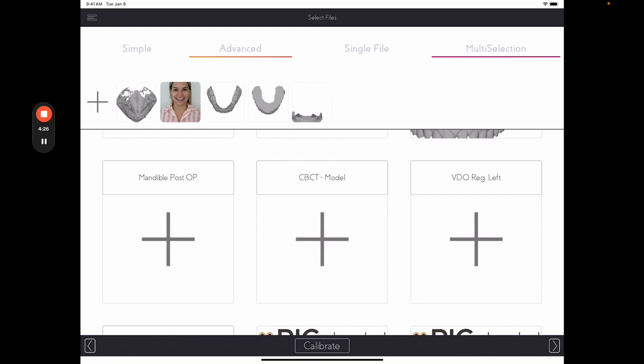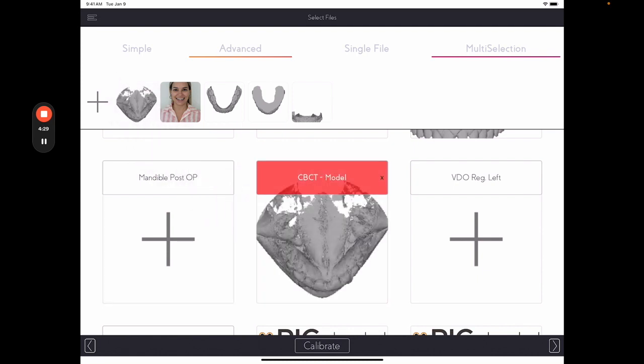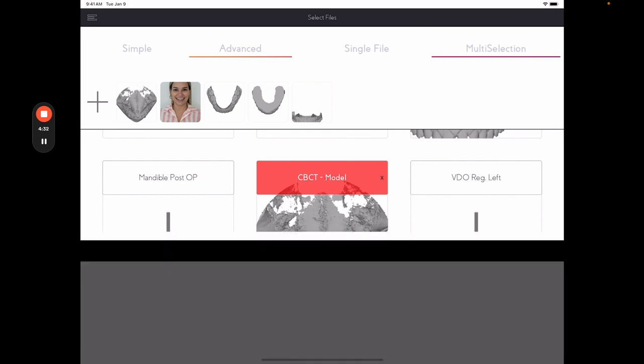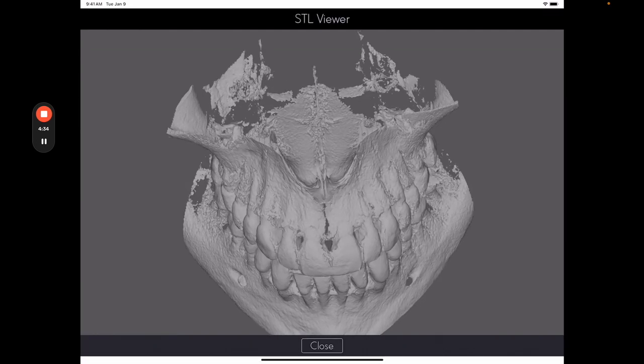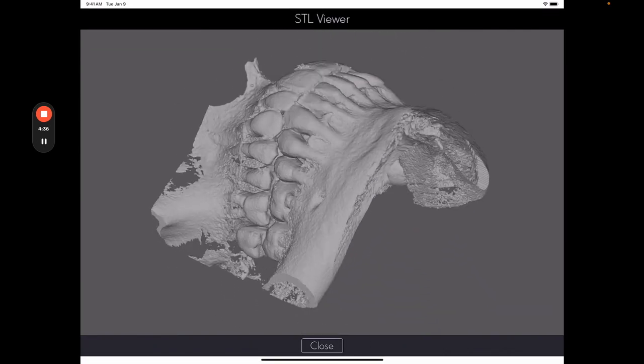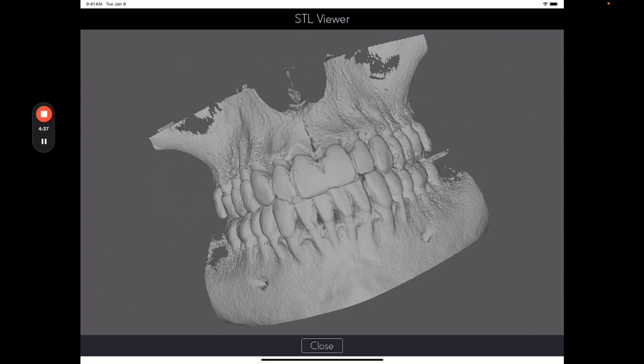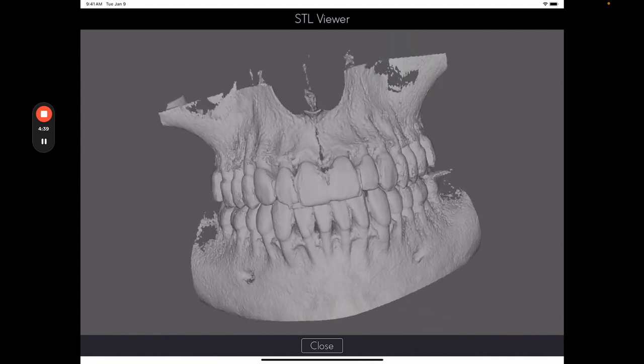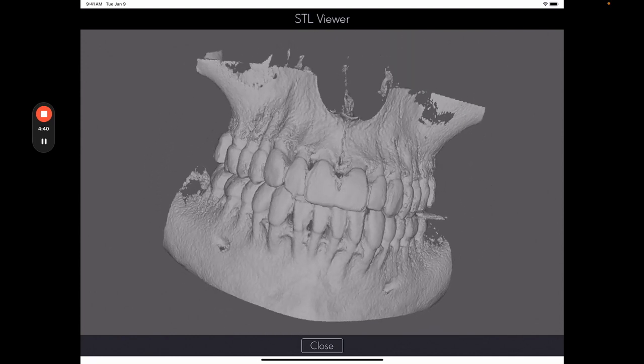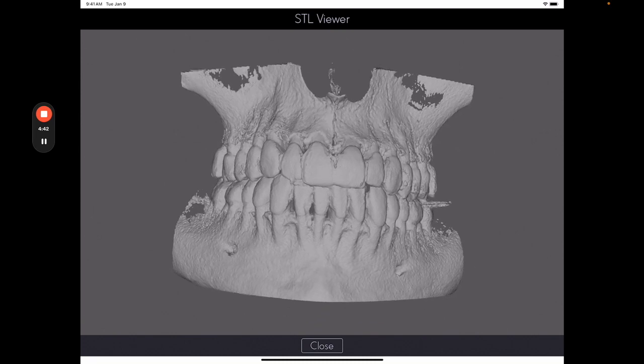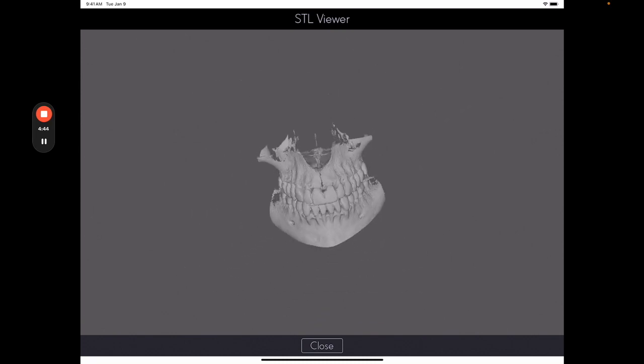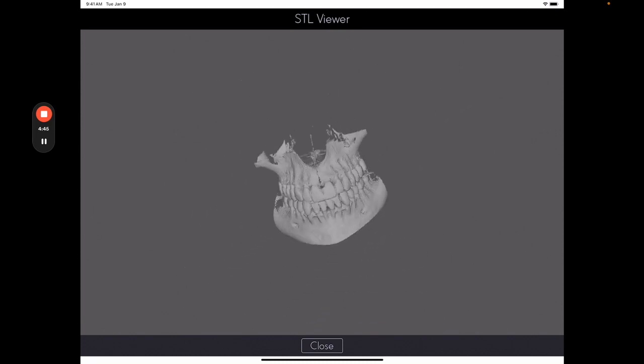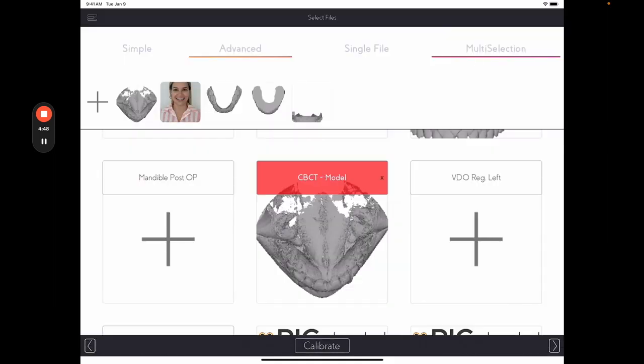The DICOM file, it's where you add the actual CBCT for you to use it as a CBCT viewer. So I already converted my CBCT DICOM file into a CBCT model, so I'm going to go over here and add this file here. I'm going to click just so you can see how it looks like. This is not mandatory, just so you know, but it's great for you to see the bone levels of your case and do a better treatment planning for your cases. That's basically how you do it.